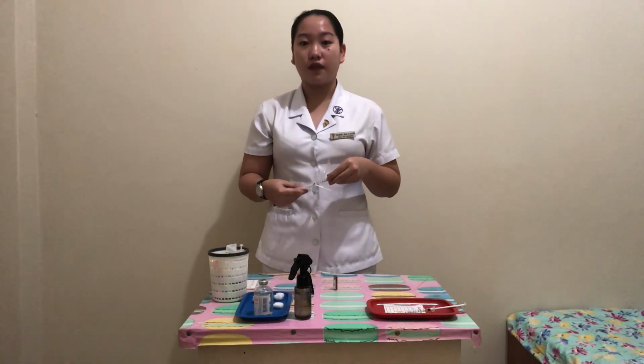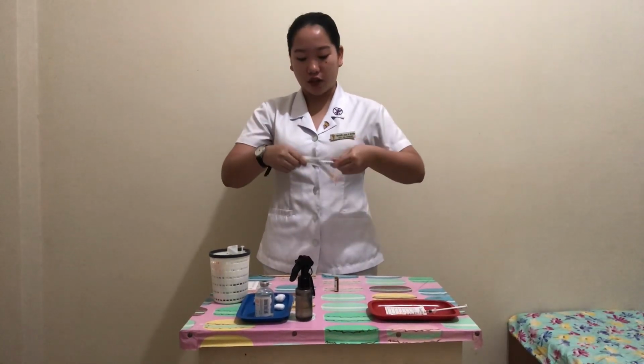And now connect the syringe to its original administration device and tighten the cap, and then place it over the medication tray until ready to administer the medication.